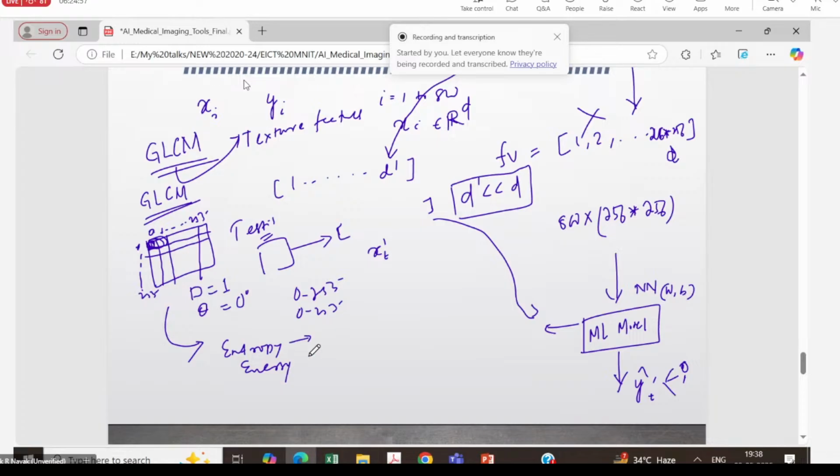So every numerical feature defines important characteristics about the image, and obviously the texture as well. Entropy basically tells us the average amount of content that is present in the image. So how can we compute it? We know the formula for the entropy, right? This is the formula. We have seen it even from school mathematics. Entropy is nothing but minus summation of pi log of pi, where these pi are nothing but the probability distribution values. But these GLCM values are not probability values.